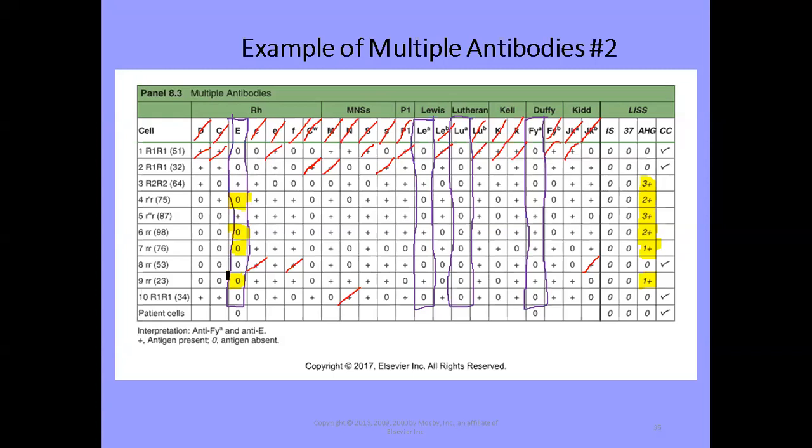Okay. So basically we see that although some of the reactions with the big E fit, okay, there are others where our patient reacted, but the antigen was not present on the cells where the patient reacted. So what that means is it couldn't be due to an antibody against E. So namely, these 4 reactions are the misfits over here.